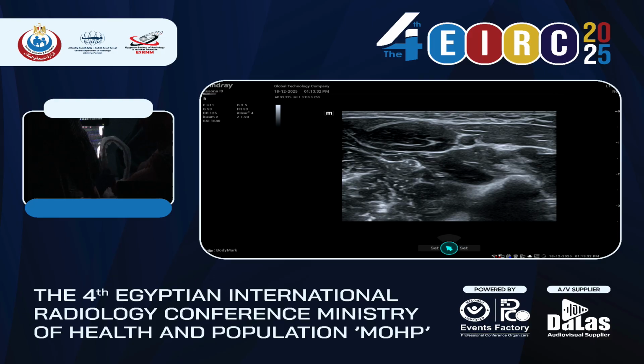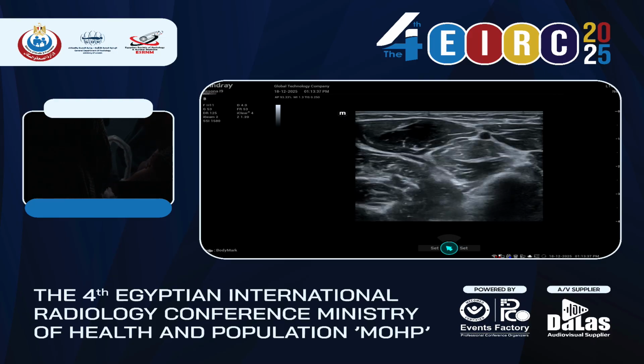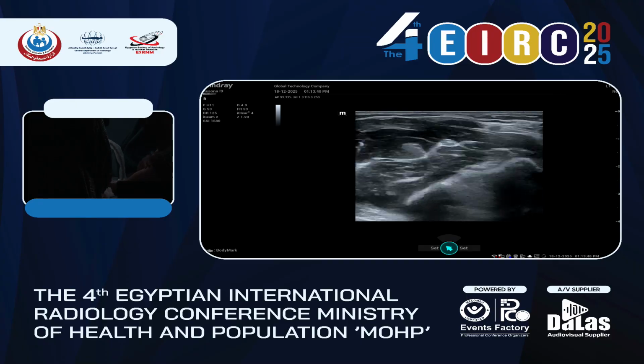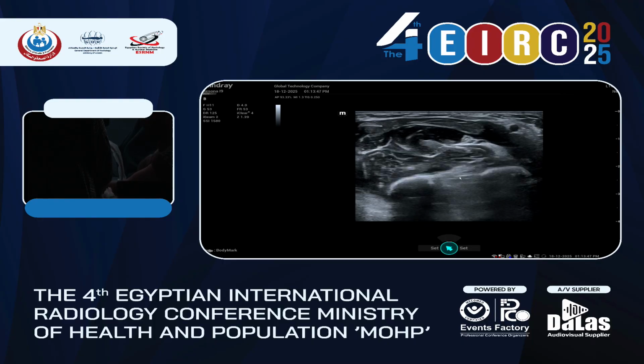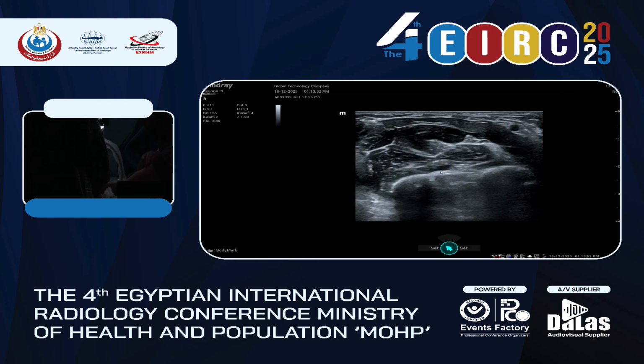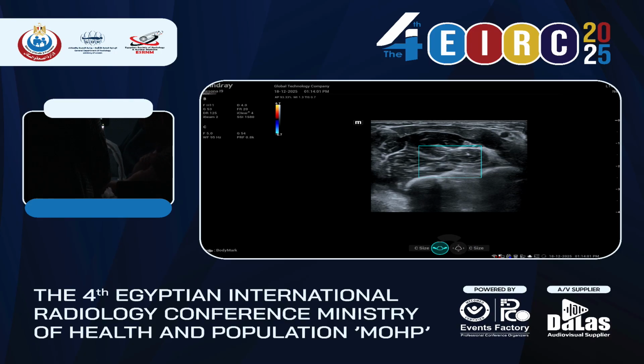Usually, we're not able to look at this nerve with ultrasound because it's very, very small. But we know that this nerve is situated near the interosseous membrane. So here we have the two bones, ulna and radius, and here we have the interosseous membrane. So the nerve should be situated around this area. The trick is to put on the Doppler. You find the little artery here, and you know that near the artery is this branch, the anterior interosseous nerve. So if you want to do a block or anything, you target there.